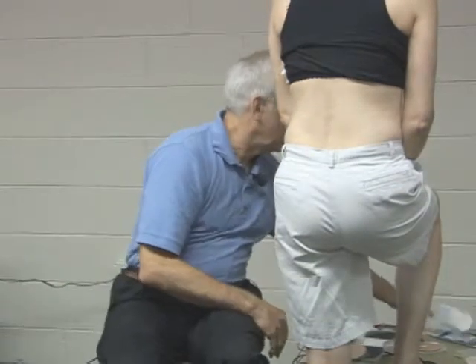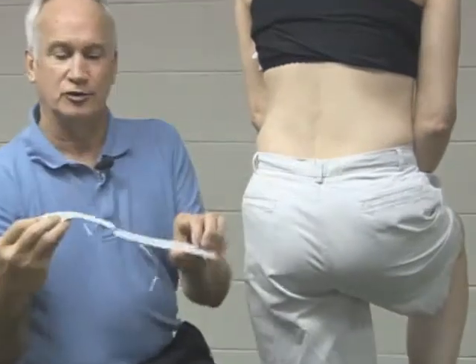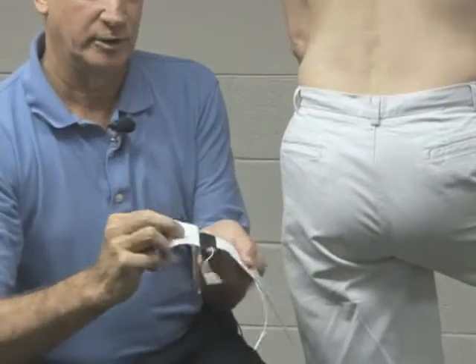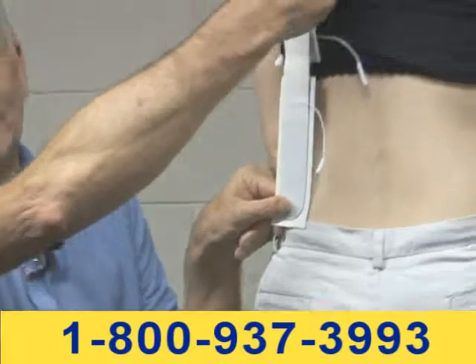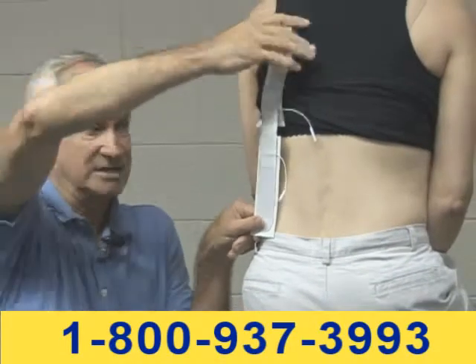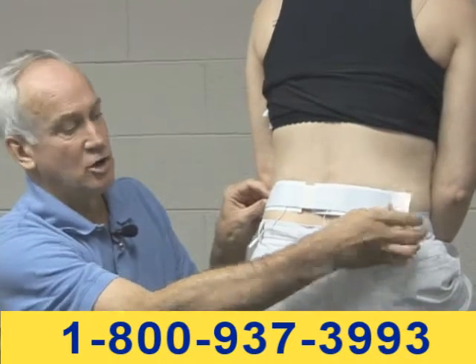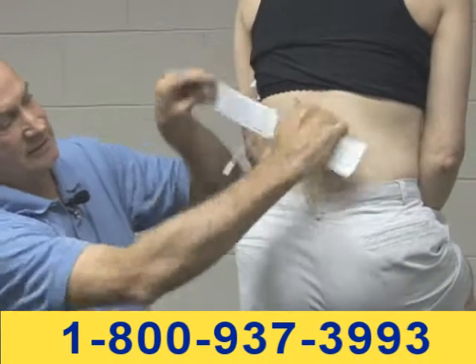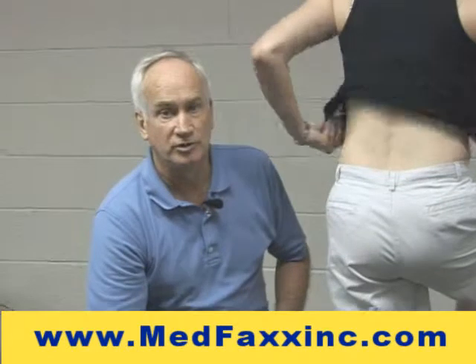Another electrode that's really popular is called a strip electrode. There's a lot of stimulation surface area on it and it's long and angular. Sometimes we can apply it one way on a patient with a great deal of pain, and most of the time it's done in this manner — or we can actually cut it to create long strip electrodes. Bottom line: there are plenty of things we can do with electrode placement for low back pain that will help you.